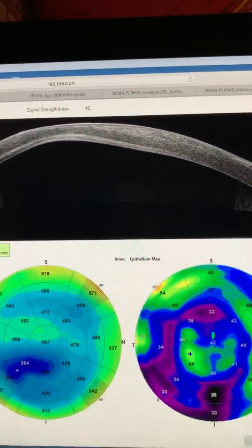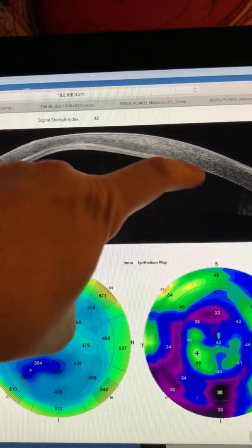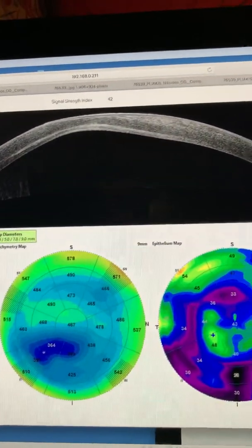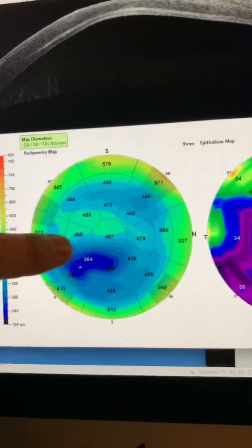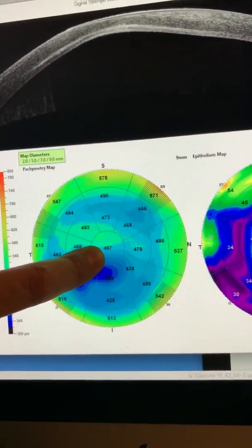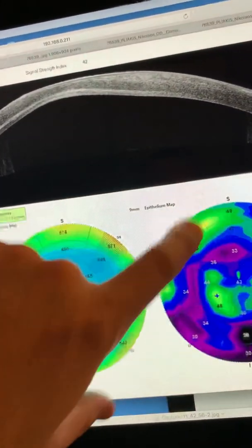Let's look at the OCT cross-sections to see that our treatment did establish very deep cross-linking line. You can see how prominent it is, and we can see that the real cornea thickness is around, in the center, around 467.